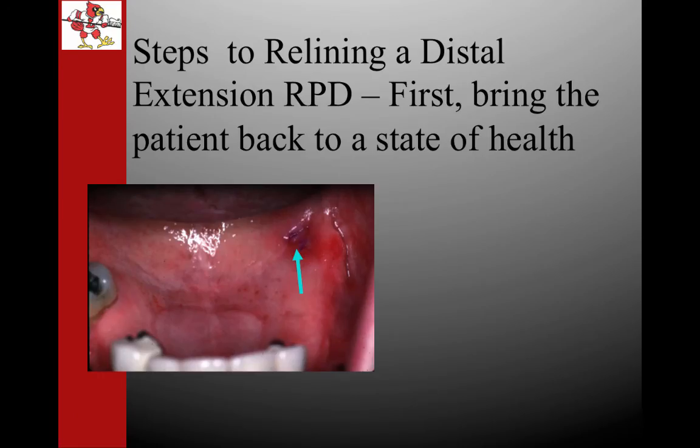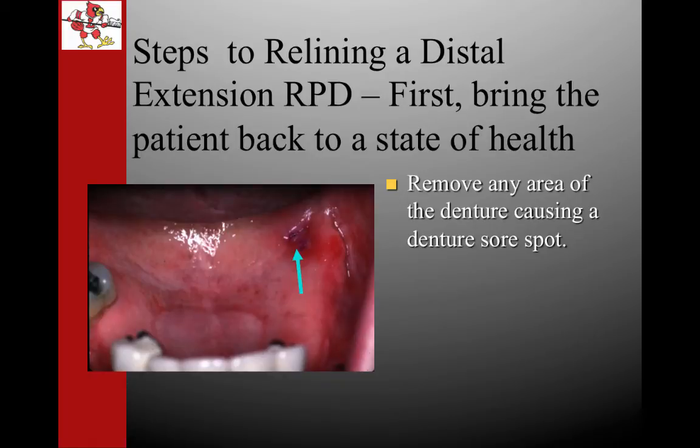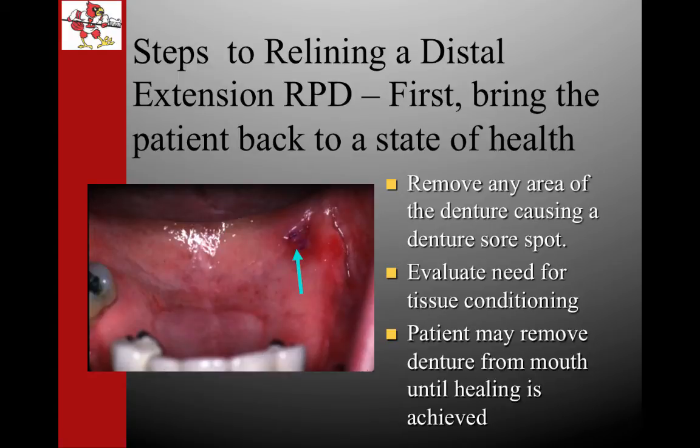We're going to go over the steps in relining a distal extension removable partial denture. First, we want to bring the patient back to a state of oral health. We're going to do that by, first of all, removing any area of the denture that's causing a denture sore spot. Then we're going to evaluate the need for tissue conditioning and do it if that's indicated. Third, we're going to ask the patient to remove the denture from his mouth until healing is achieved. This is not always possible, and that's one of the reasons we consider tissue conditioning.